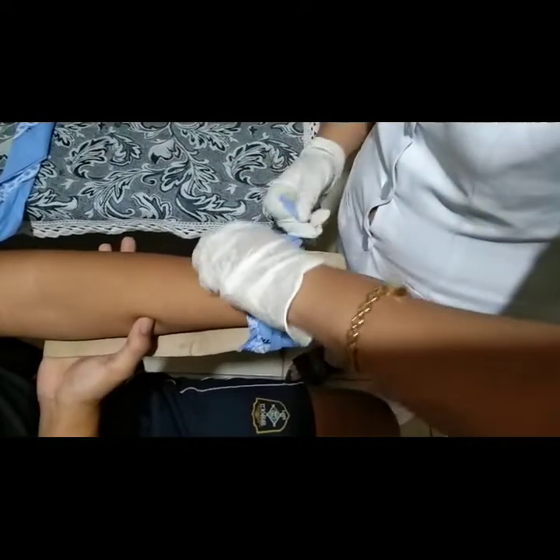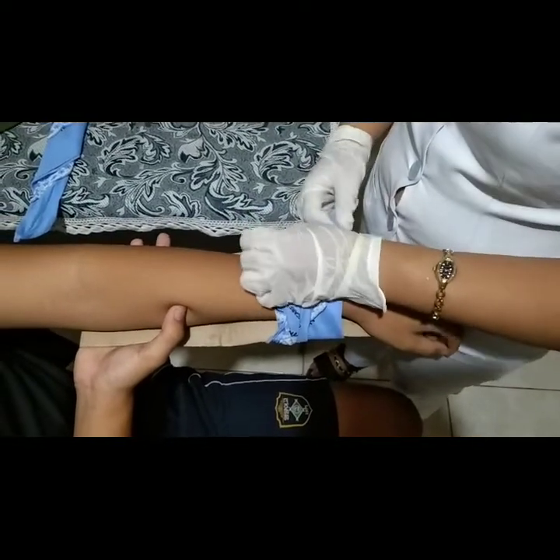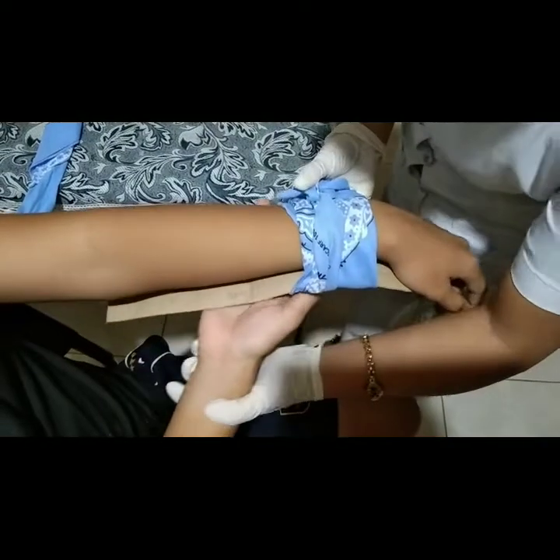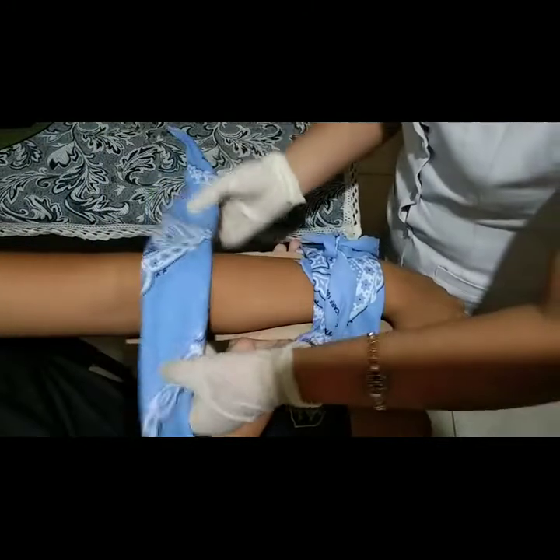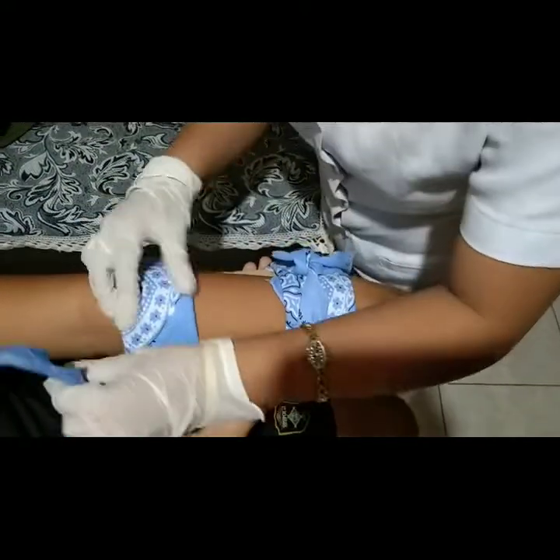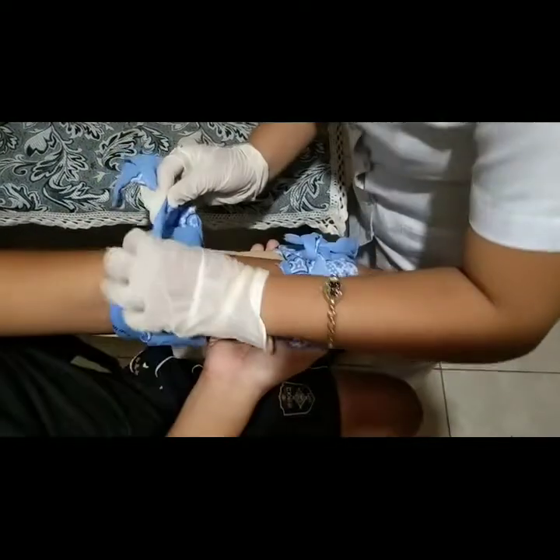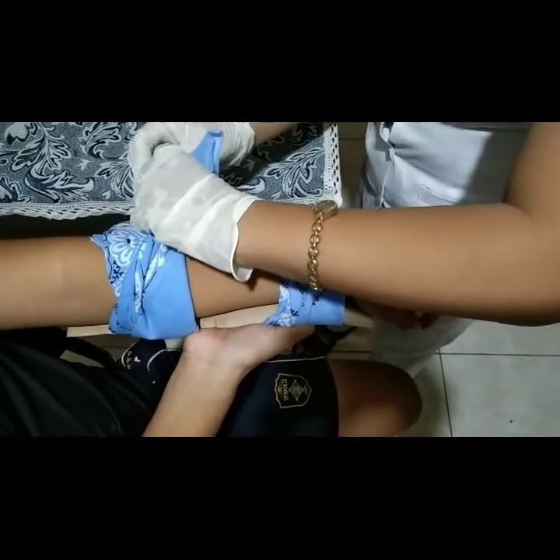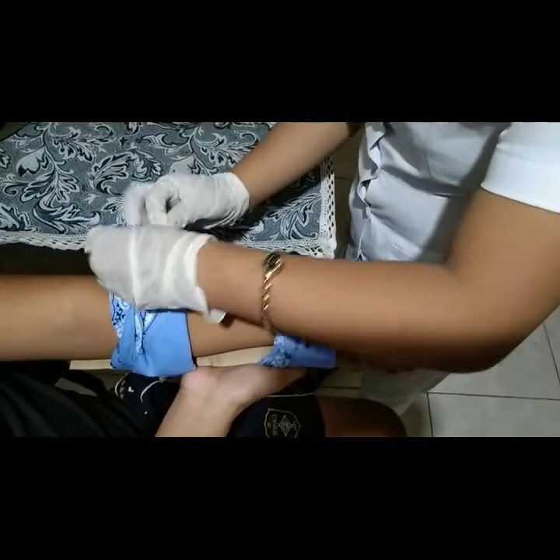Ask the patient to support this area while you are going to tie above the injury. Sir, please support this area. Again, make sure to tie a knot at the side of the splint so that you will not impede the circulation of the blood.